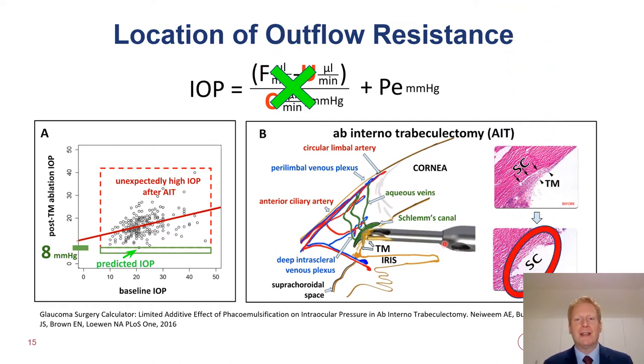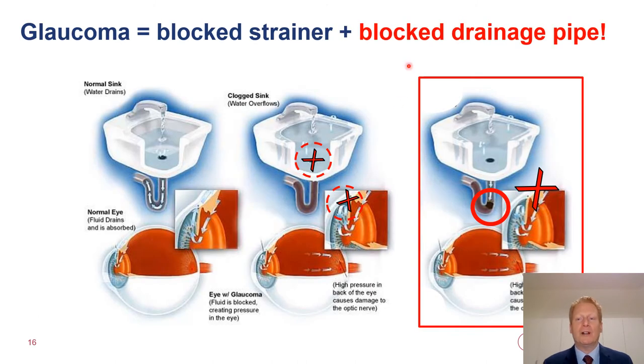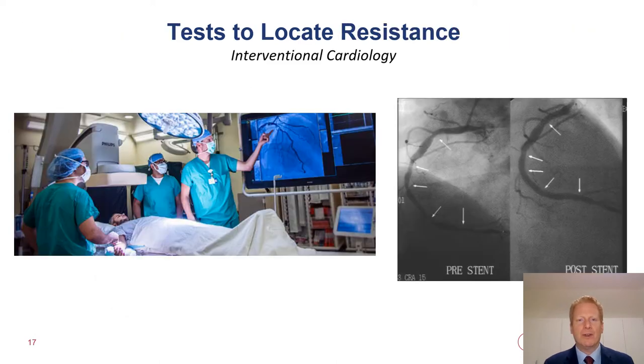We remove it and we do not obtain the episcleral venous pressure. Well, it has to be an obstruction somewhere distal from our strainer tissue. So that's a nice way of explaining to your patients why trabectome surgery, a Cahook surgery, or a trabecular meshwork disruptive surgery does not work. But where is this? We simply don't know.